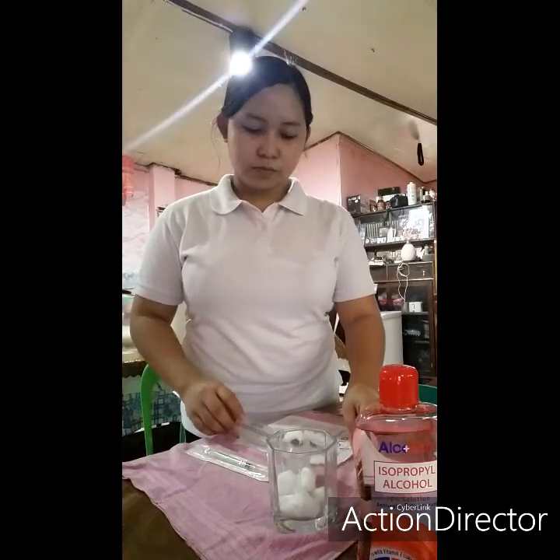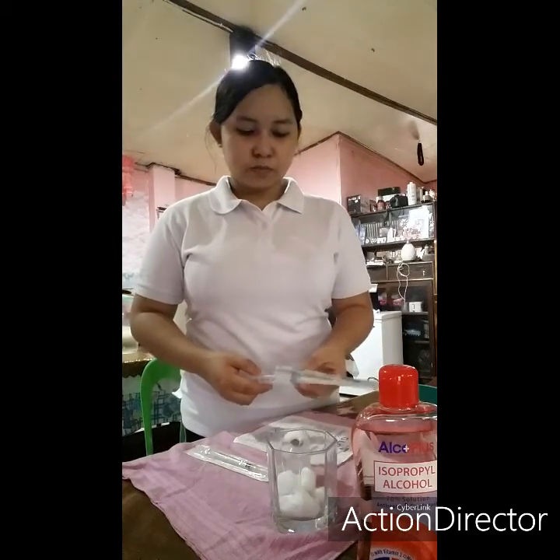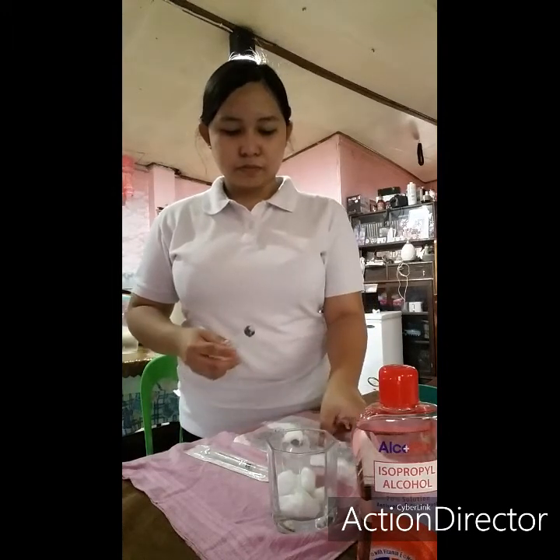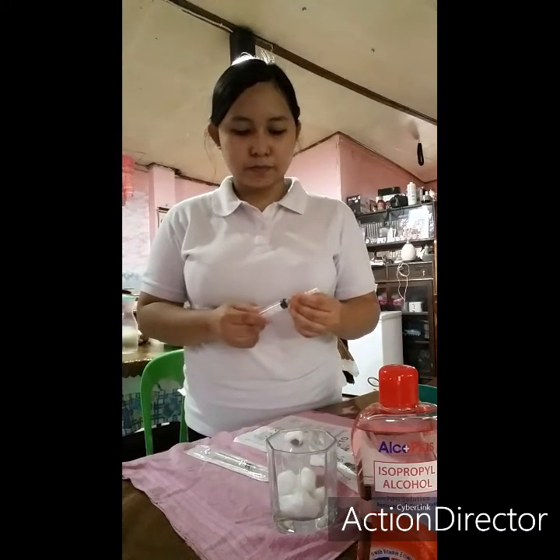And now, aspirate the right dosage we need for this intramuscular injection. We will be needing 2 ml for this. Remove the original needle and change it with an aspirating needle.